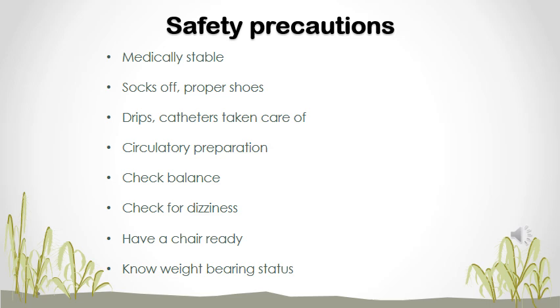Know their weight-bearing status. What that means is you have to find out if they are allowed to put their full weight on the injured leg or only partial weight on that leg, or if they should actually not put any weight on that leg, and that is called non-weight bearing.